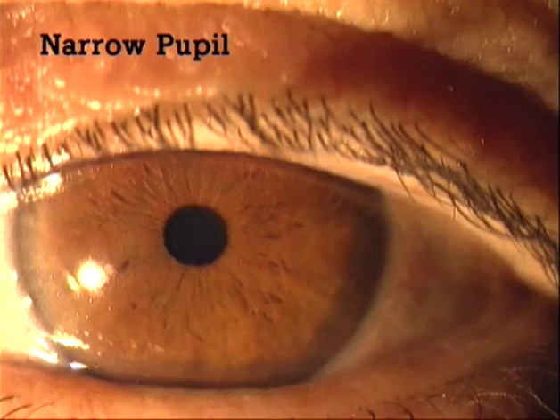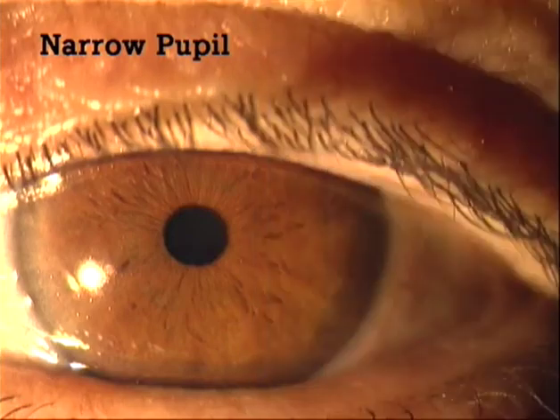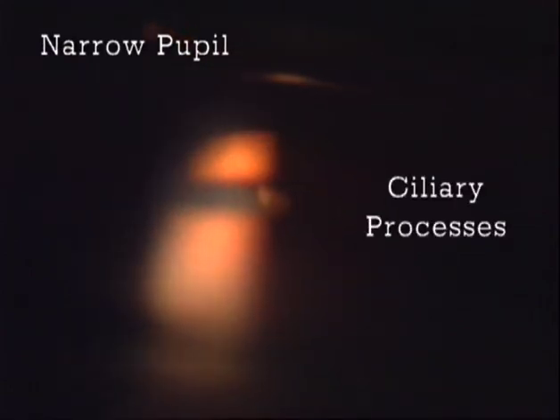For example, this is the other eye of the patient with the flat anterior chamber we saw before, but here the pupil is narrow. The narrow pupil, of course, restricts the field of view, but nevertheless, even the ciliary processes can be seen here.